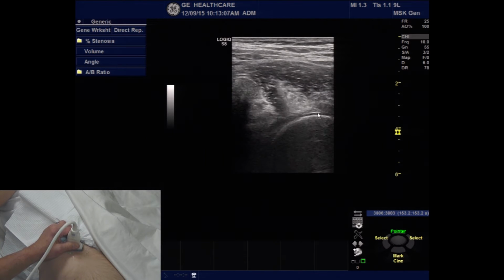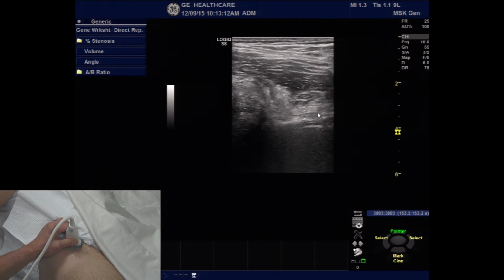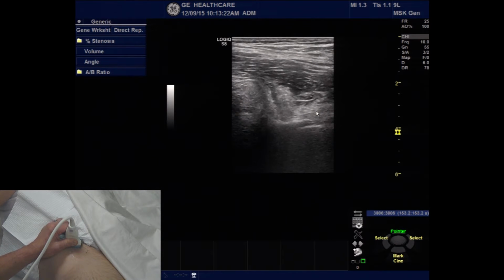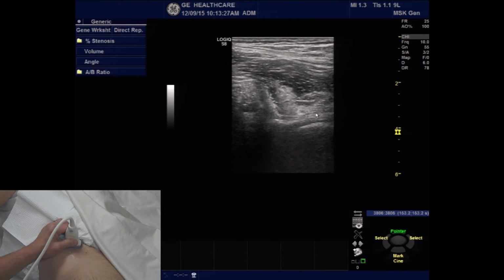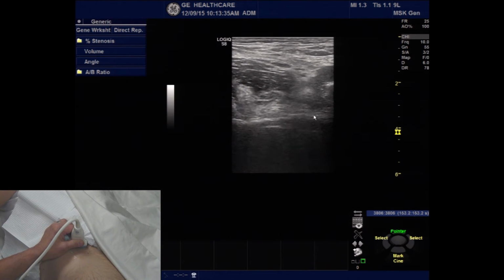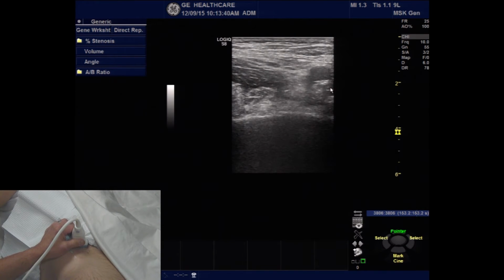Now, sitting just superficial, sliding the transducer slightly back up onto the acetabulum, you're going to see the area of the short axis of the conjoined tendon of the iliopsoas. Now, this is a nice area or projection if you're going to be doing an injection technique into the area of the iliopsoas. If I slide the transducer slightly medial, I'm going to see the femoral artery and vein, which are structures that we certainly want to avoid during any type of injection technique.